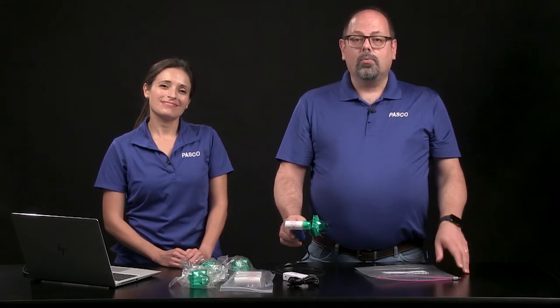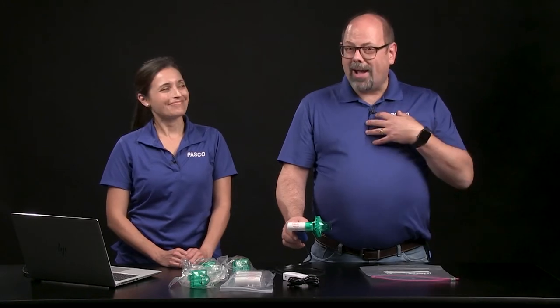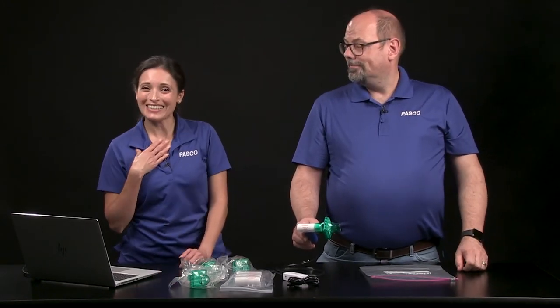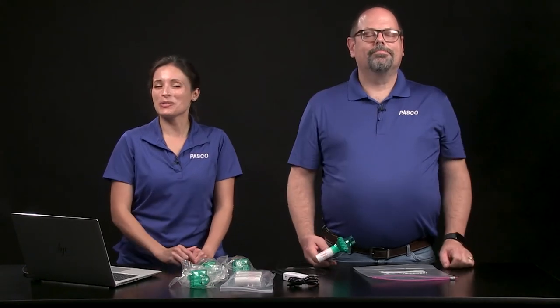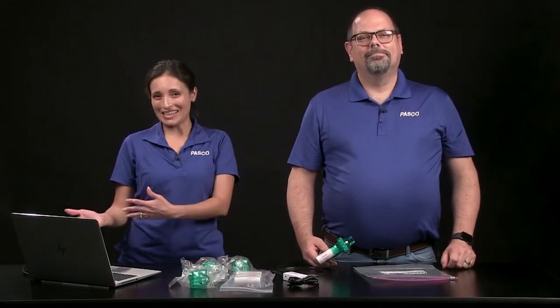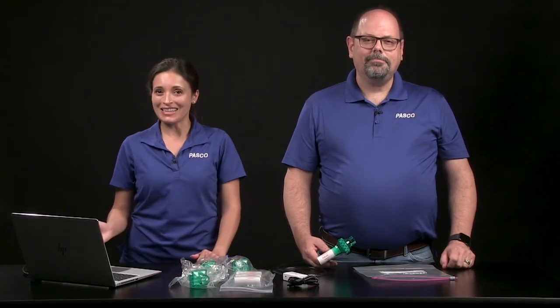Once assembled, work in pairs so one person is the test subject and the other is in charge of data collection. The test subject should be relaxed and can either stand or sit. They cannot look at the data while it is being recorded, so the lab partner can coach them through breathing cycles while collecting data.